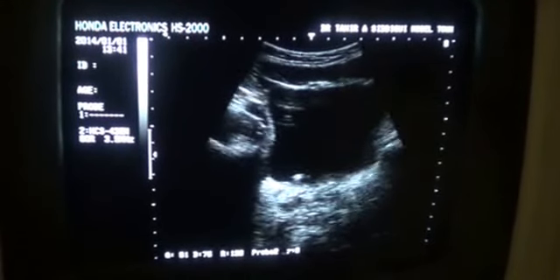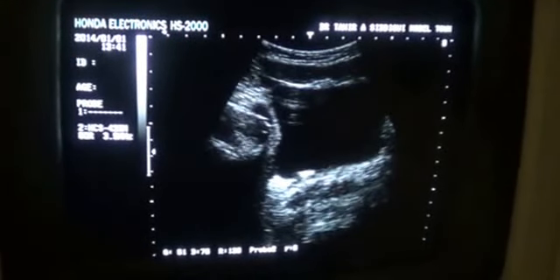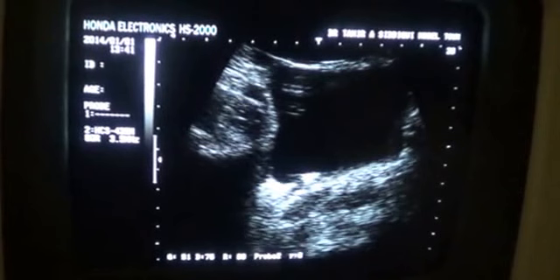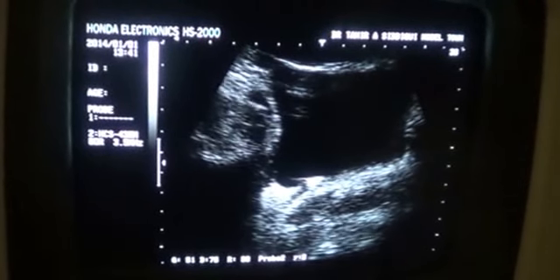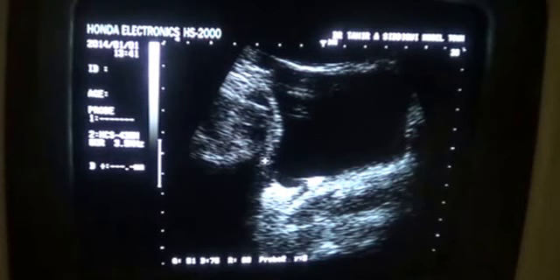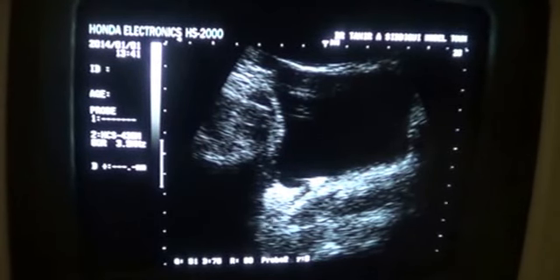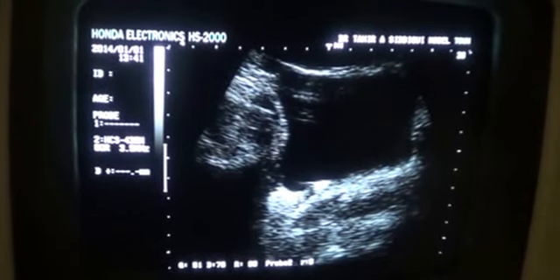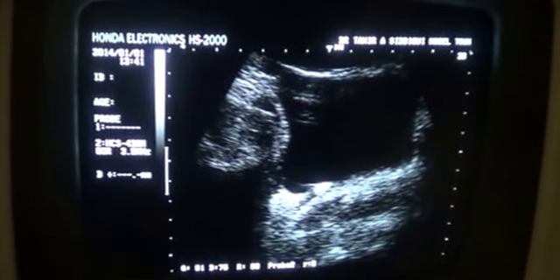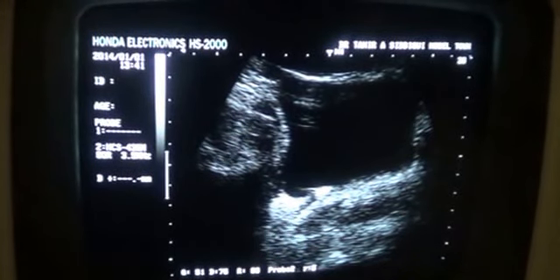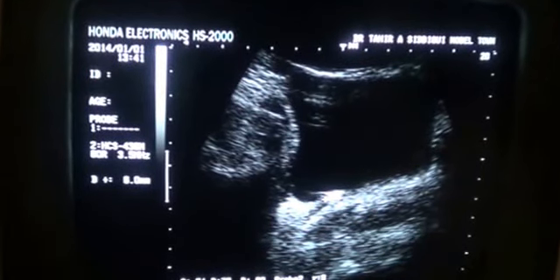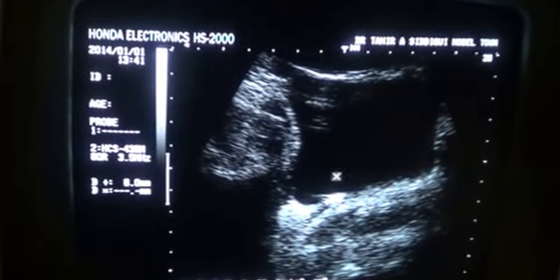Let us concentrate on this region. Let me magnify it and make it more clear. This is again the urinary bladder in transverse section. This is the distal part of the right ureter opening into the urinary bladder. This is the calculus entering into the urinary bladder lumen, and the calculus measures 6 millimeters.